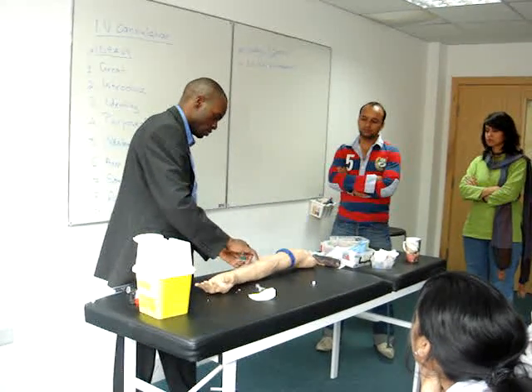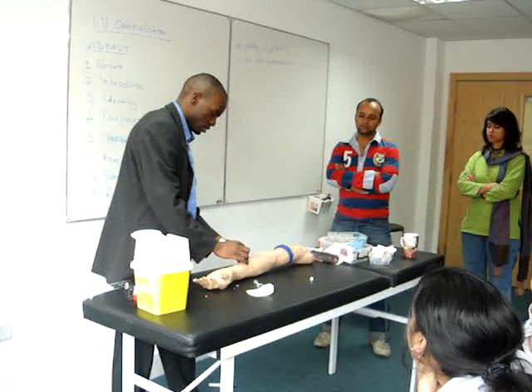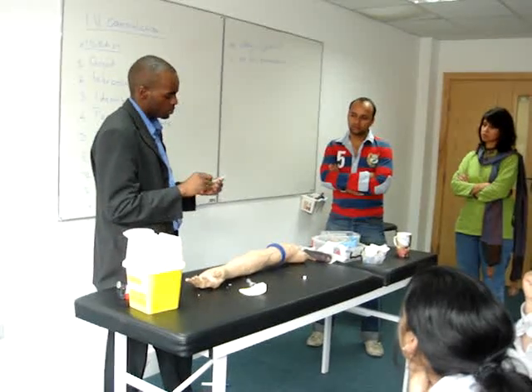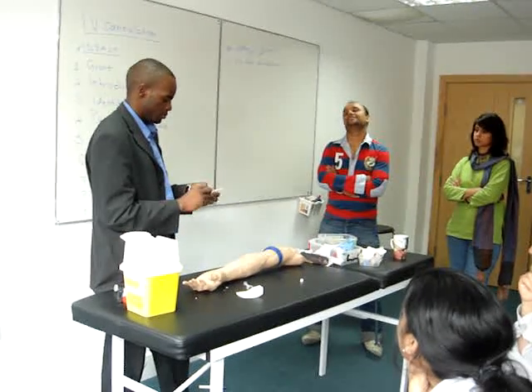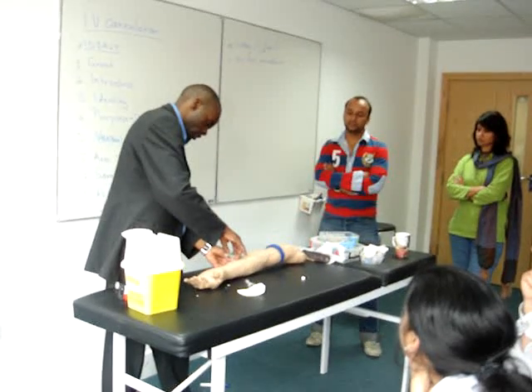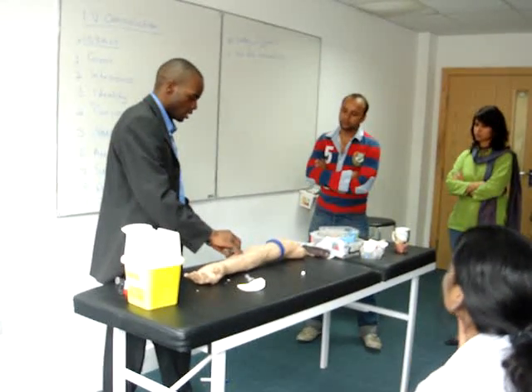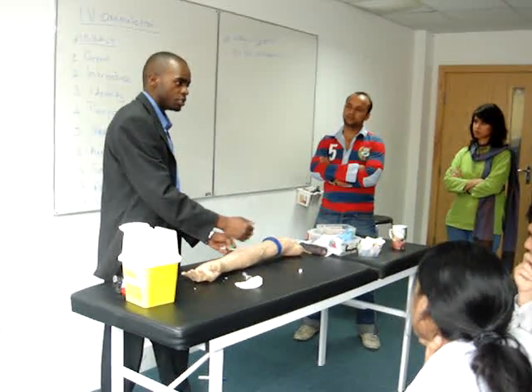Break. There you go. Go forward — it comes slightly. Go forward, it comes slightly. The blood should come from there. That's why when you went in for the first time, when I break for the first time, I went slightly then stopped there. So they need it just somewhere here. Just slightly. So when I go up, if I am going to come backwards slightly, it will immediately appear there. And if you see blood, then I find you.